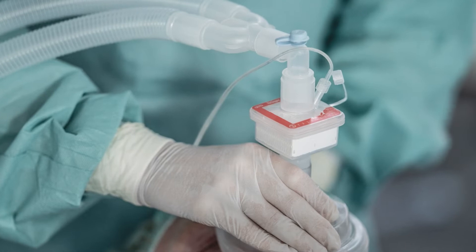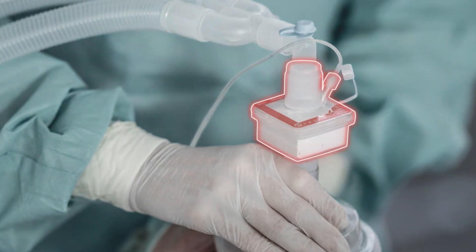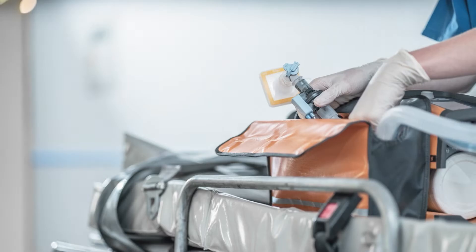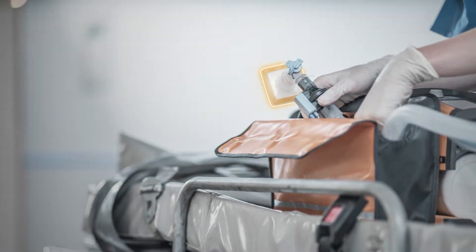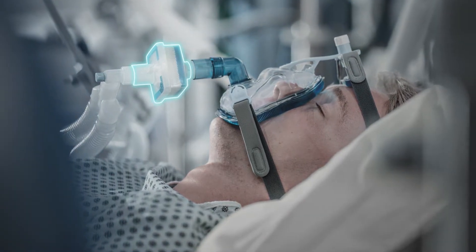At Draeger, we tend to think of filters like that. This filter, for example. And this one, too.